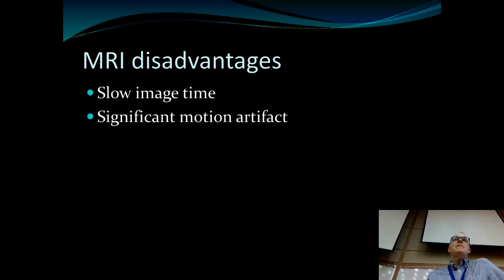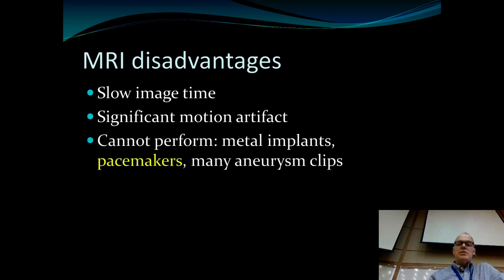Yes? Is there a difference in quality between the open MRIs and the closed MRIs? Yeah, that's a good question about open MRI scans. There is a little bit of difference. With closed MRIs, we can get a bit more detail, but I would say it's not that significant. So if you do have someone who's claustrophobic, an open MRI is a really good option. And oftentimes, if someone is claustrophobic, we'll give them a little sedation just to help them make it through the study.